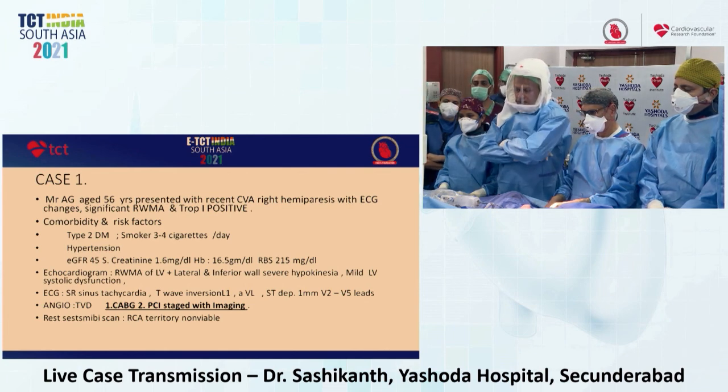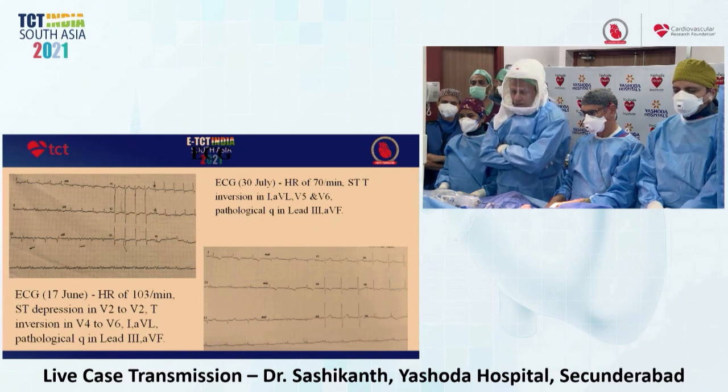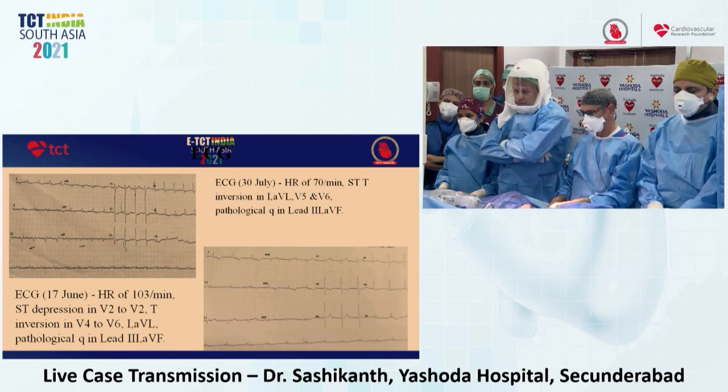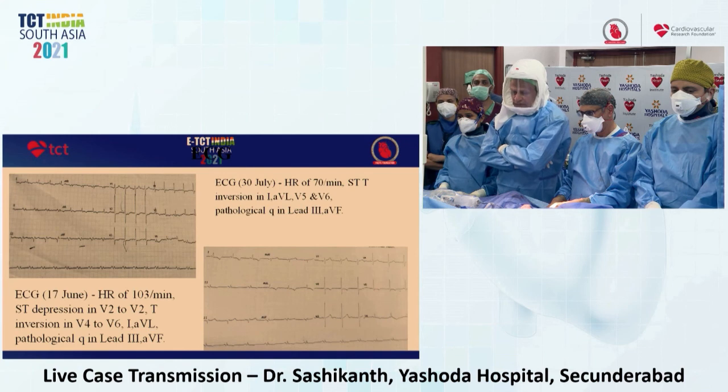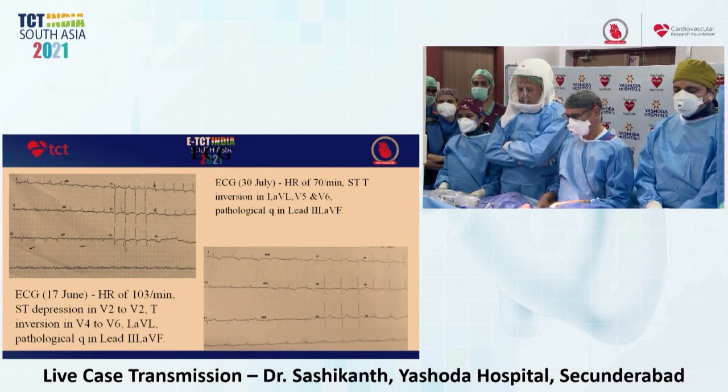Can we go to the next slide? ECG showed significant changes at the time of admission, with T-wave inversion in L1 and aVL, and ST depressions in V2 to V5. His ECG subsequently, just yesterday, showed a significant improvement in the ECG changes with the treatment he had received, sorbitrate. Can you go to the next slide?